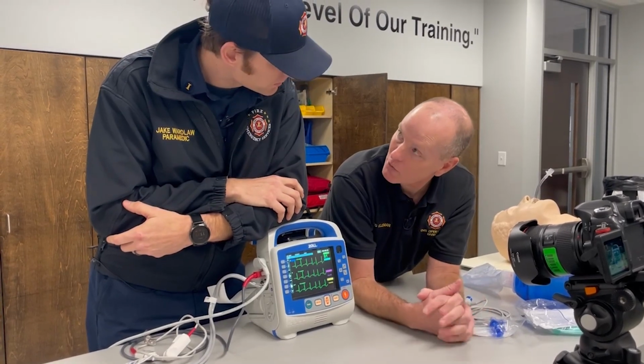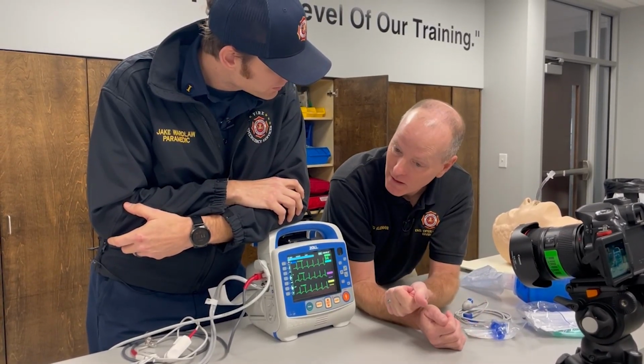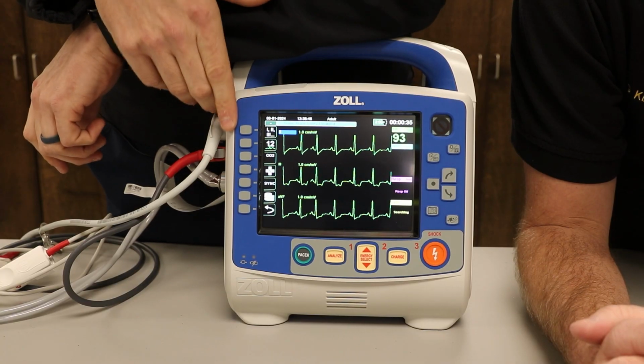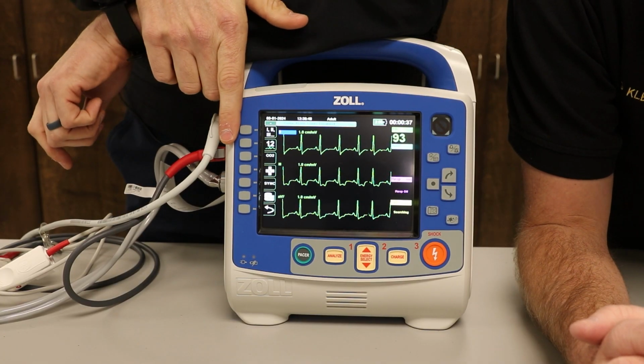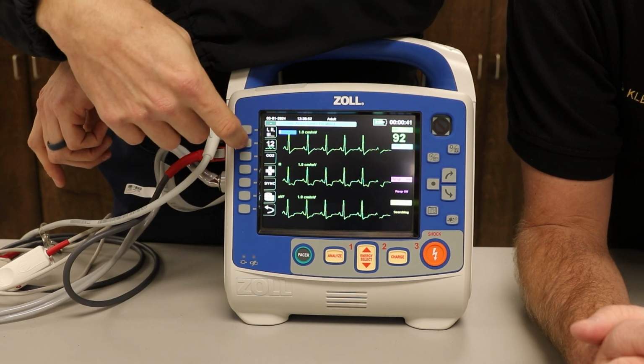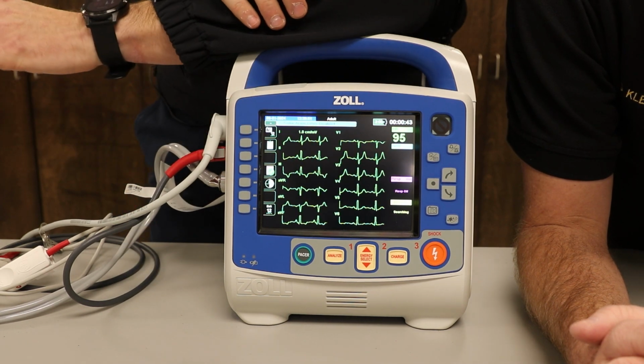Let's show them how to do a proper 12 lead, and then more importantly, how we can transmit that 12 lead. Of course. You're going to go to the second button down, second gray button down. You will see a 12. That means 12 leads, a 12 lead mode. So you'll select it. This will actually take you to the 12 lead setting.